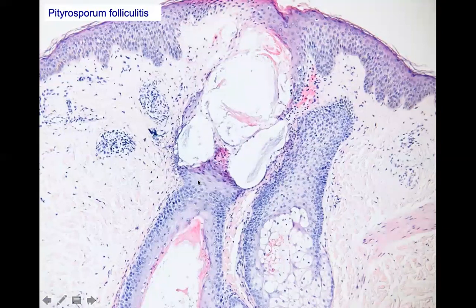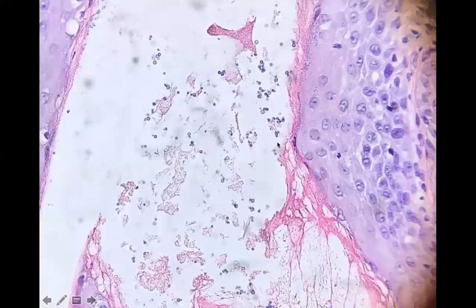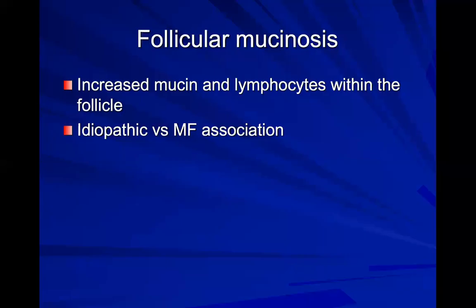This is just an example of a folliculitis due to pityrosporum, okay? Sometimes we see that if it's in a very seborrheic distribution, say upper chest, upper back, maybe these are just along for the ride and they're not pathogenic, or if they're not responding to your benzoyl peroxide, and I see a lot of pityrosporum, I'll tell you that I see it in the follicle, and maybe then a Nizoral shampoo will do better for this patient.